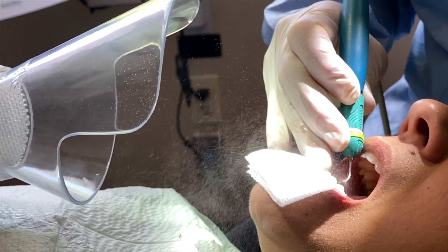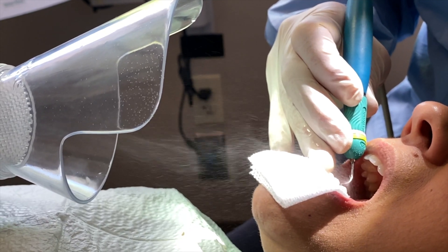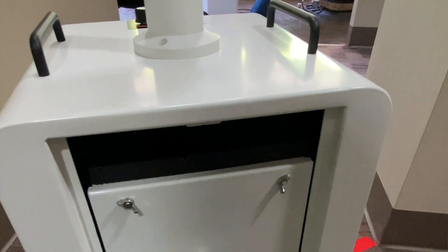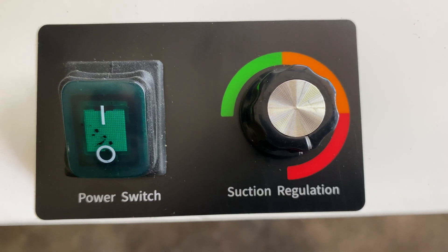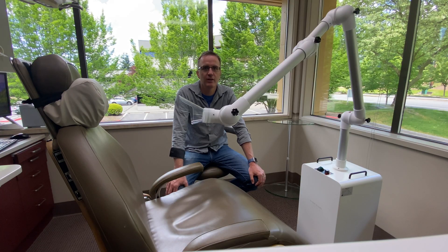You can see from the video — you turn this thing on and those aerosols are going right into this machine. It's a great filtration system. You can take off the back and change the filters as needed. There's an on/off switch and a suction strength knob, so crank it up and get drilling.